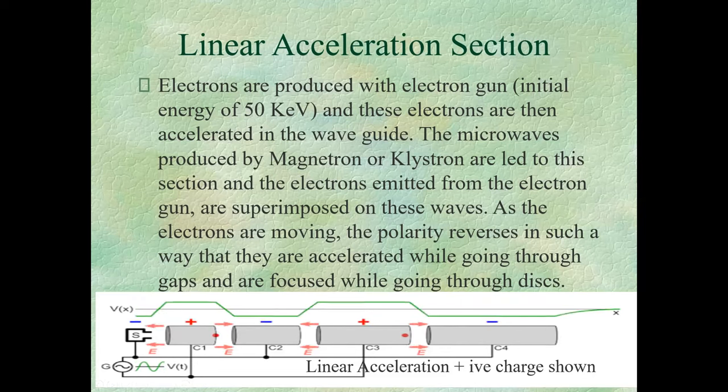And which is better, the ion chamber used in TrueBeam, or the ion chamber used in Elekta? I don't know the answer to that. But ion chambers can go bad in Elekta linear accelerators or Varian accelerators. They can puncture or start losing the pressure of gas in them. So there can be a lot of factors that can affect them. But which one is better, I personally don't know about that. Sorry for that. Okay, thank you.